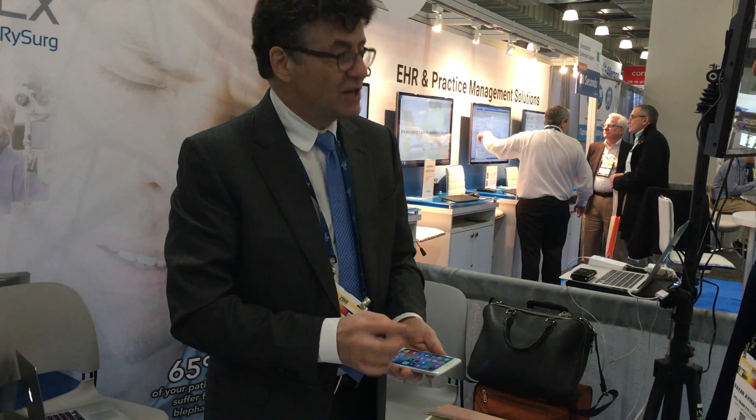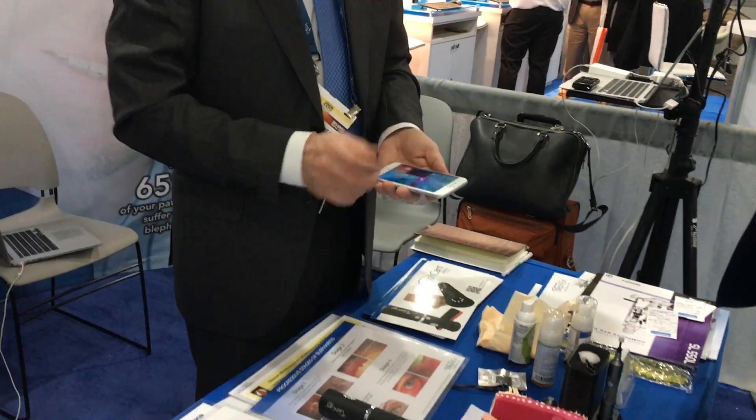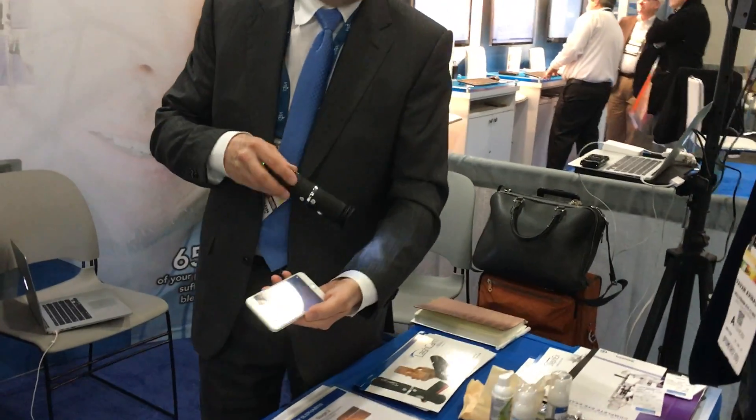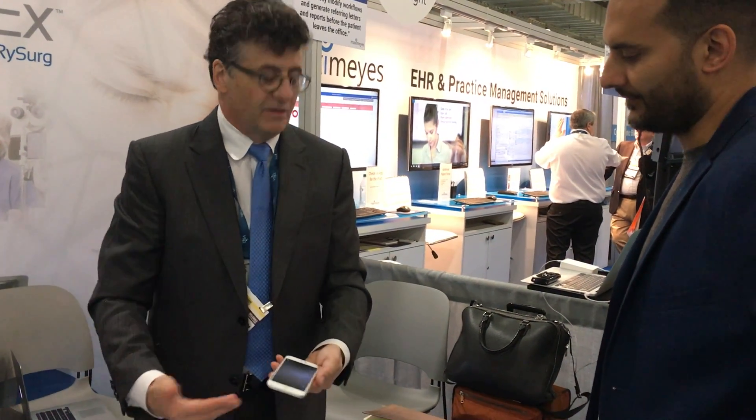Then you go to your Lash Cam app — it's a small app. You can get it on Google Play if it's Android, or the Apple Store if it's an Apple device. Click on your Lash Cam app and you can see the live signal. You have to have that app downloaded on your device before you attempt to connect the devices.